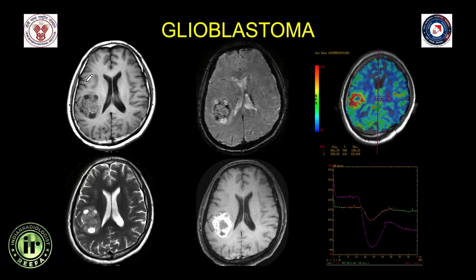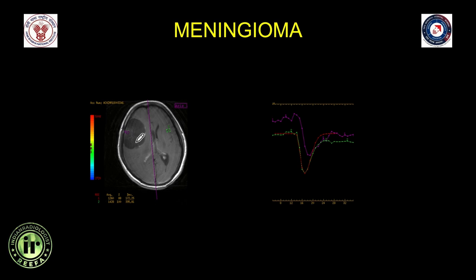An elderly patient with a heterogeneous right parietal lesion showing blooming (from hemorrhage/hemosiderin), heterogeneous post-contrast enhancement, and very high CBV of approximately 3.4 compared to contralateral white matter with approximately 50% baseline recovery, consistent with a high-grade neoplasm. A meningioma case similarly shows high rCBV compared to contralateral white matter and lack of complete baseline recovery due to absence of blood-brain barrier in this extra-axial lesion.